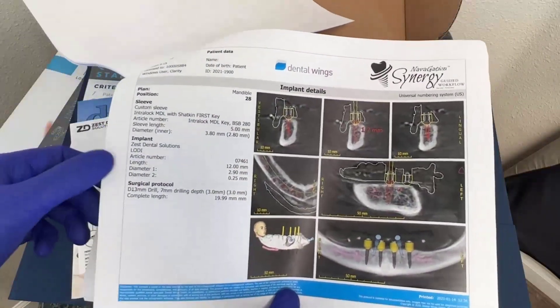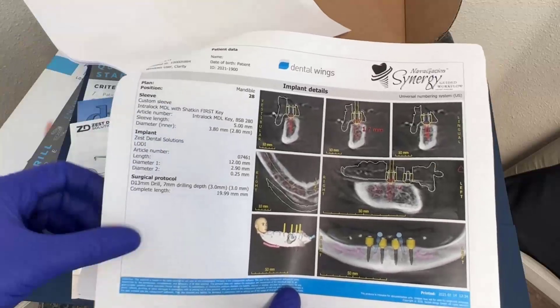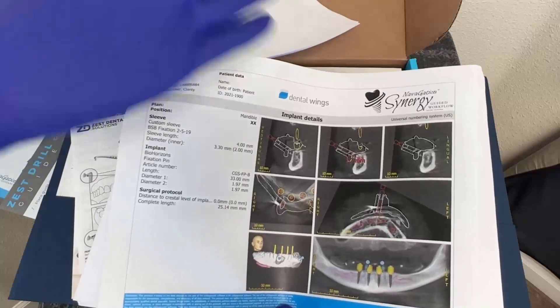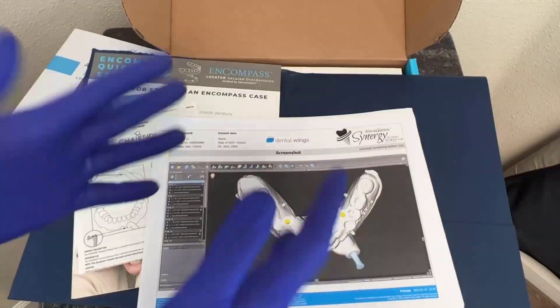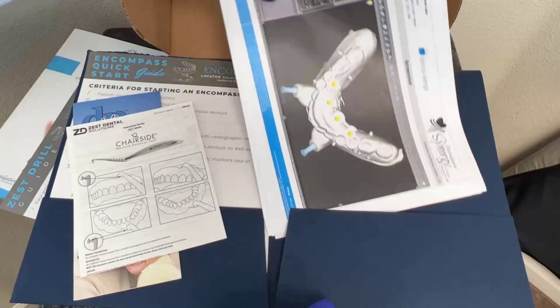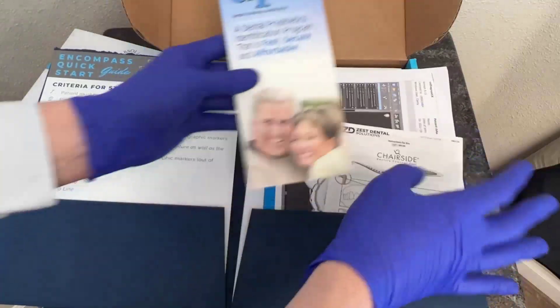For my 3D planned cases, especially for my Encompass and Navigation Synergy group cases, I like to go ahead and take these, print them out, because I've got a really good idea of where the implants go, my anchor pins — in case I'm in the middle of surgery and already gloved up and sterile, I've got a reference for me at any given moment. I'll put these away for now, so this will give me kind of everything put back together.